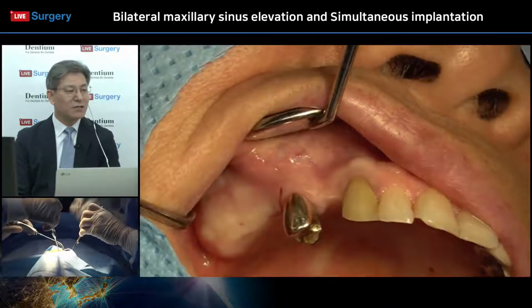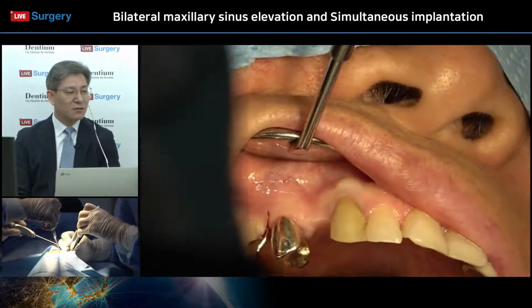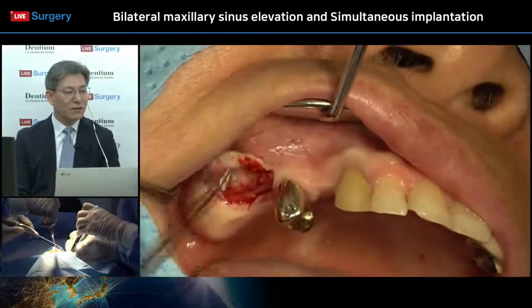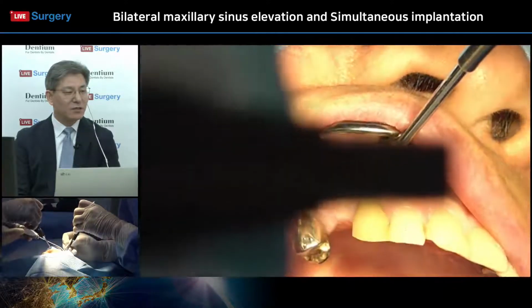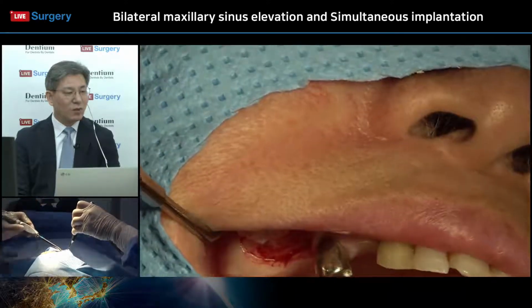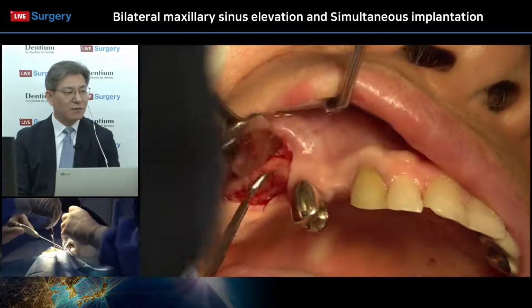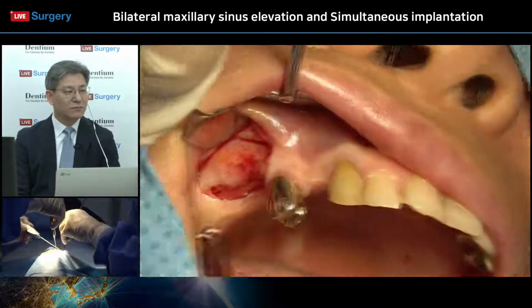The papilla conservation incision was done. After that, a little bit more, looks like a semilunar incision. Clear cut. Checking the clear cut. Using a small round curette to reflect the flap. Very simple, with a little bit more vertical incision and more flat reflection on the surgery site. Then try the elevation, and after that drilling of the implant site.